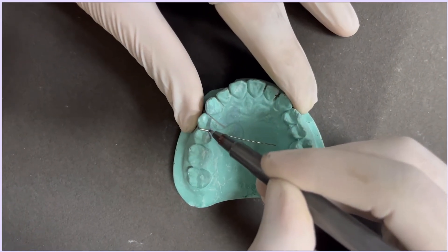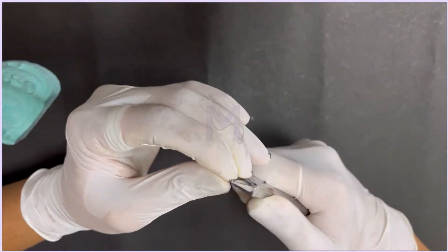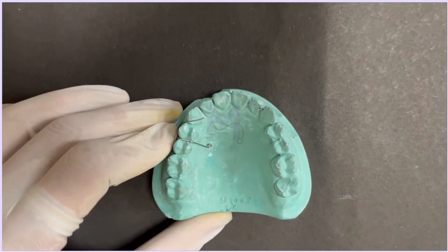Next, mark a point on the wire as shown and bend it downwards to form the retentive arm of the retractor. Give a retentive tag at the end of this arm to prevent damage to the tissue.